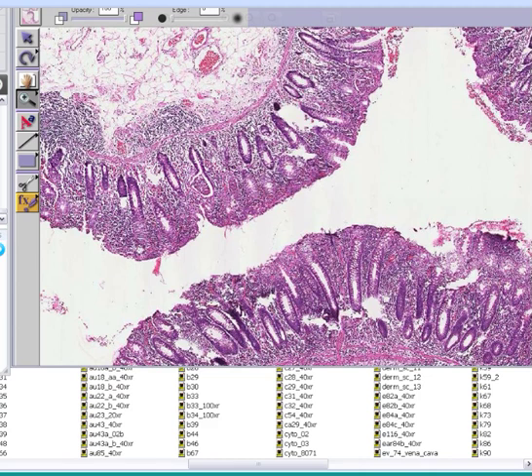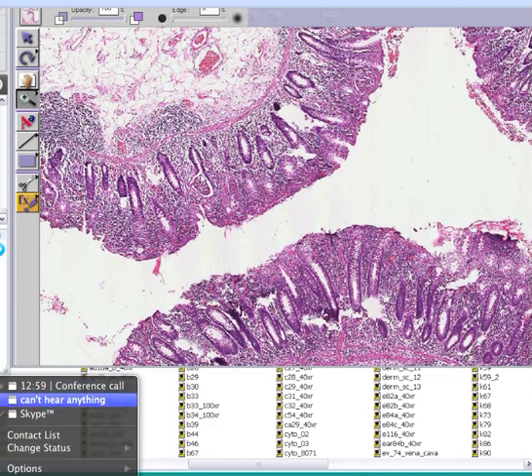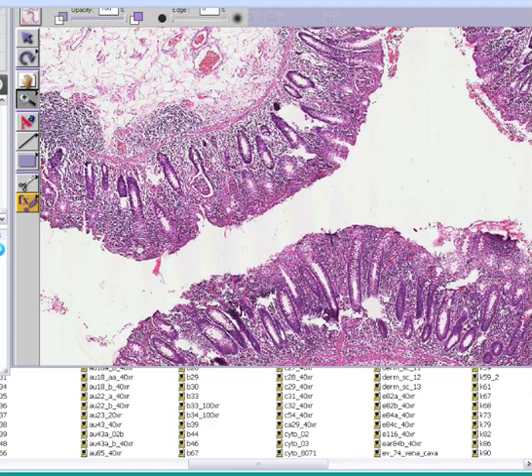And in addition, these infiltrates of inflammatory cells, which look primarily like chronic inflammatory cells, seem to be a little bit more than usual. And it even looks like there's a collection of inflammatory cells within this crypt of Lieberkühn. And that's what they call a crypt abscess.